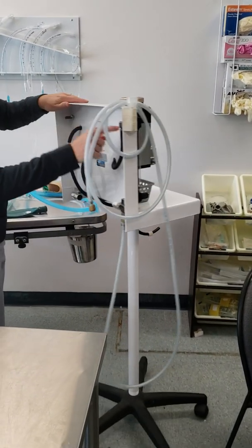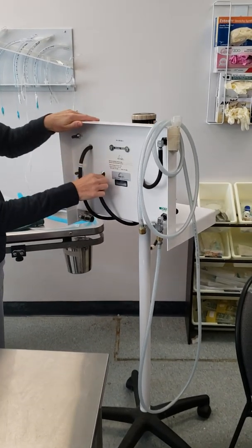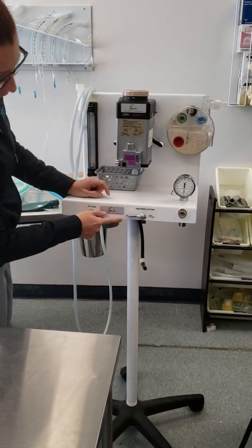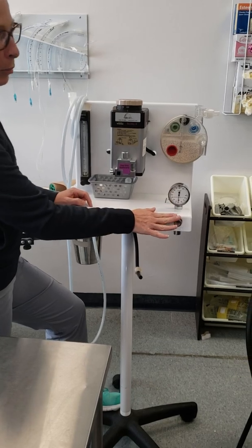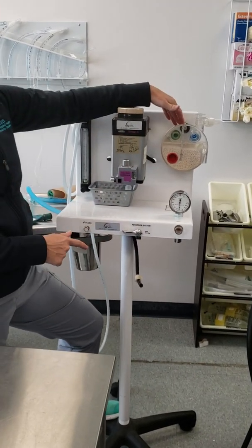So flow meter comes out through the back, and you'll actually go through the vaporizer, okay? And you can see the vaporizer feeds down through here. Okay? Down here is where a couple things happen. So for this one, this little switch here controls whether we are using our non-rebreathing or our rebreathing side of the machine. So absorber stands for rebreathing, right?